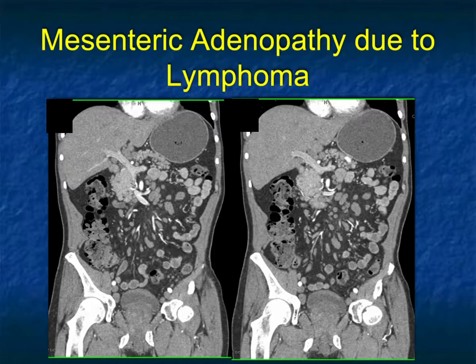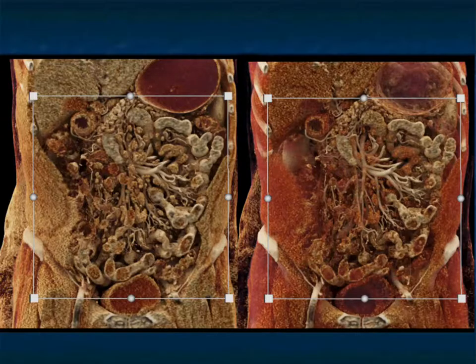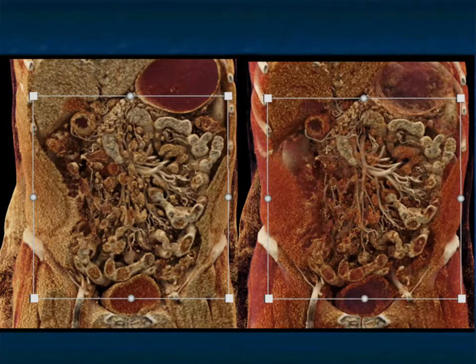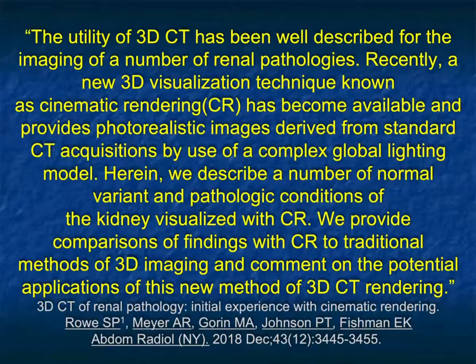Here's a case of lymphoma with large mesenteric nodes — multiple mesenteric nodes. This shows how it looks with cinematic rendering: a really nice look at the bowel, the multiple nodes, the vessels, and everything in combination.